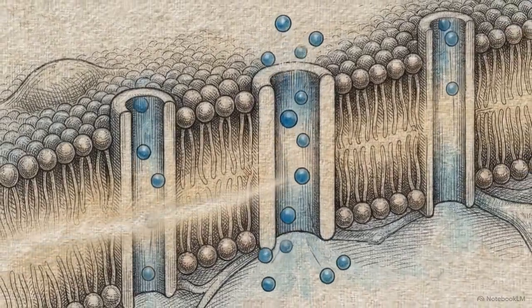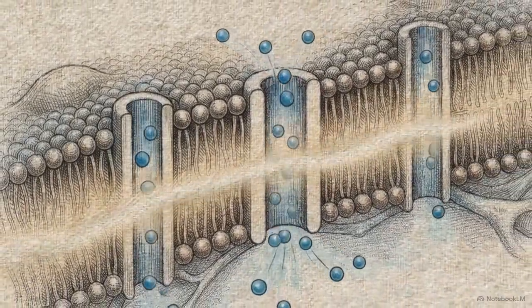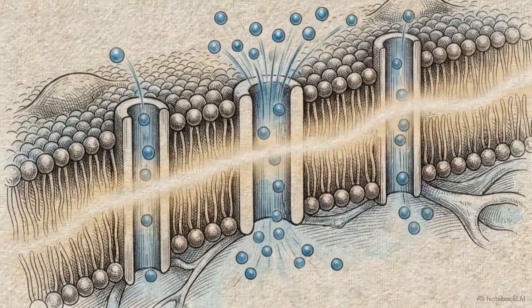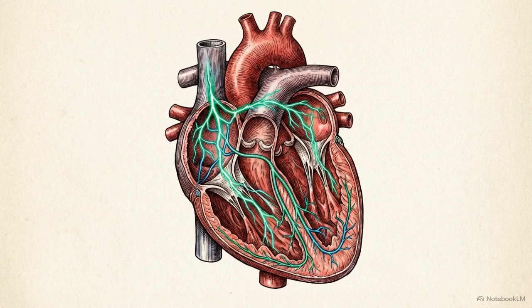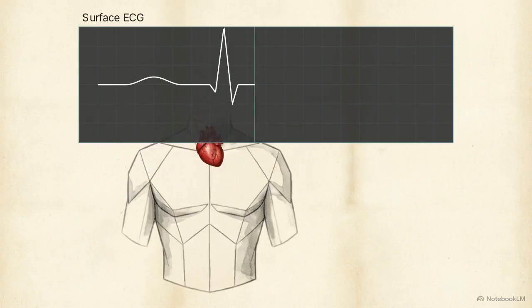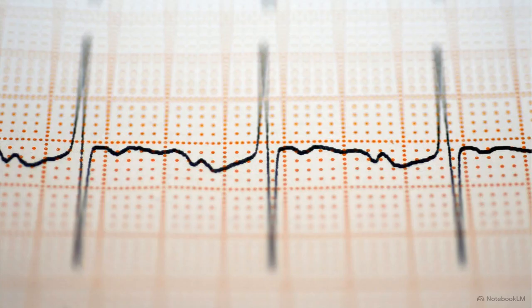Every heartbeat begins with ions flooding across microscopic channels in a single cell membrane. This tiny voltage shift is the basic unit of a coordinated wave involving billions of cells firing in rapid succession. The surface electrocardiogram captures the aggregate, delayed echo of these action potentials as they wash across the cardiac muscle. This complex electrical storm is usually presented on a stark two-dimensional grid.